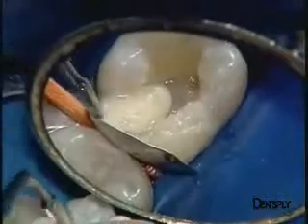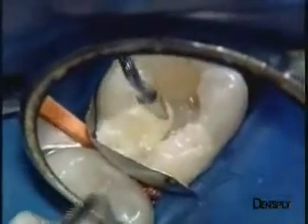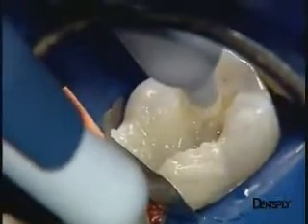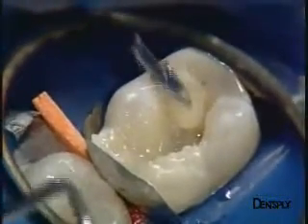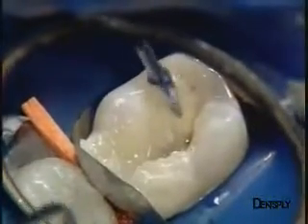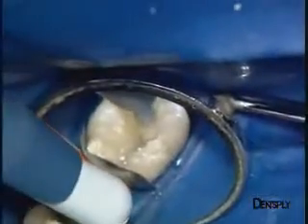We will now start with the restoration of the occlusal anatomy — that is to say the whole of the occlusal surface and the various cusps and bulbs that make it up. A count should be taken of the orientation of the bulbs at mesio-vestibular cusp level. The Ceramix Mono is especially easy to work with, does not flow and initially takes the form that would be expected of a bulb in terms of convexity.